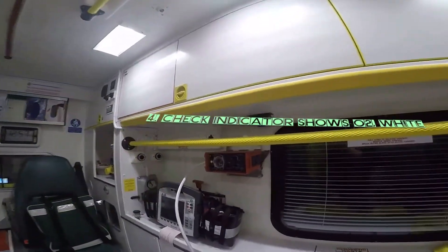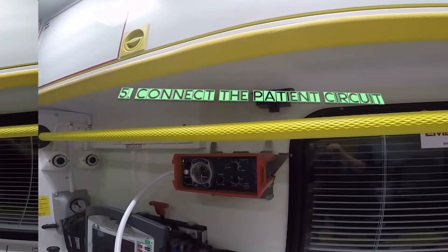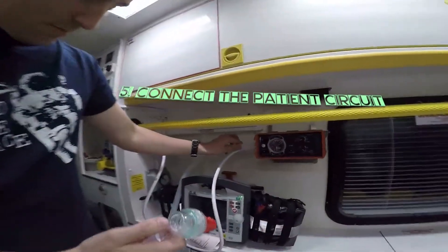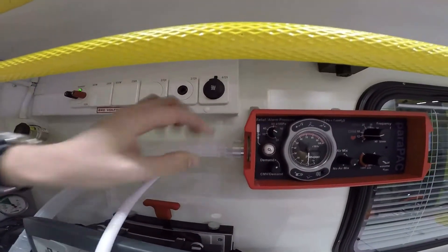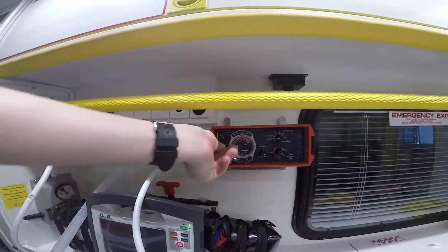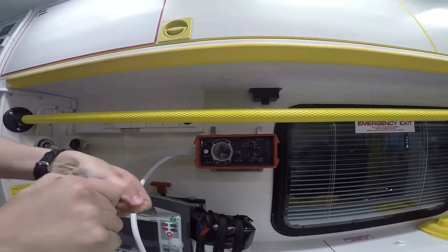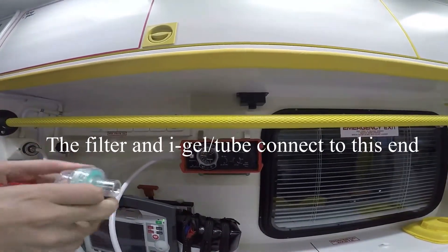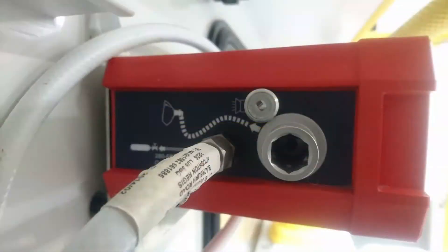Next, check the indicator is white, which means there's O2. Connect to the patient circuit. This is just a close-up of where the patient circuit connects to.